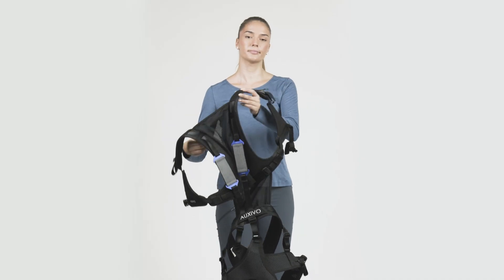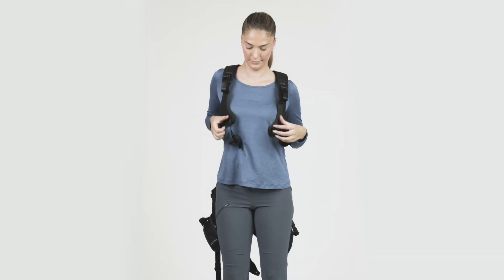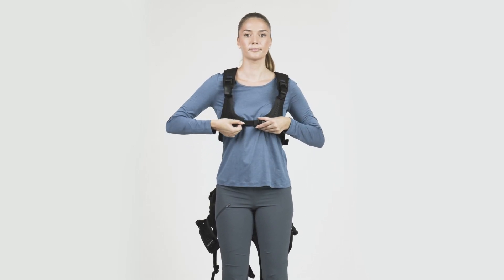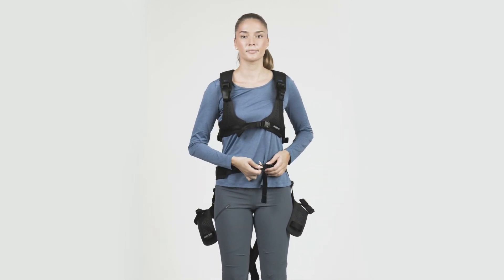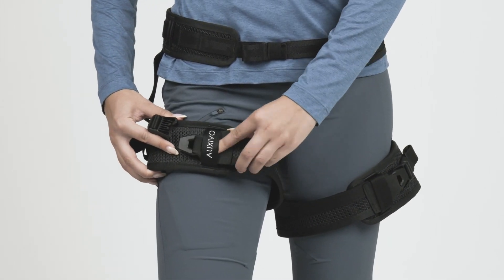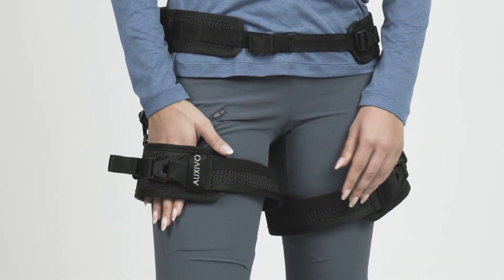Once you are familiar with the features of the LiftSuit, you can start donning it like a backpack. Close the vest using the buckle in front of your chest, and for now, tighten it only slightly. Next, close the hip belt and tighten it slightly. Continue by closing both thigh cuffs and tightening them so that you can still place one hand between your leg and the cuff.